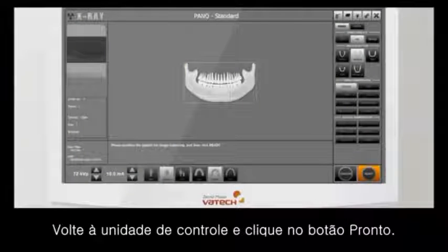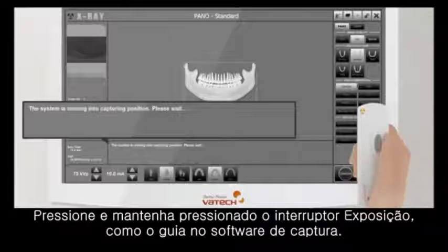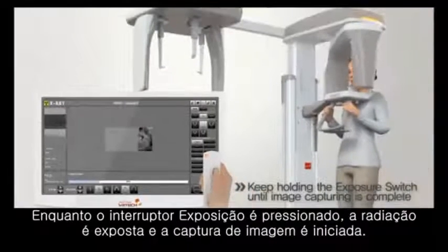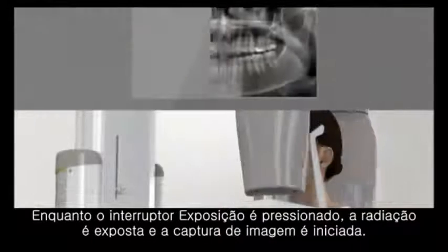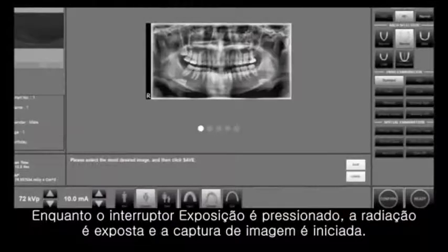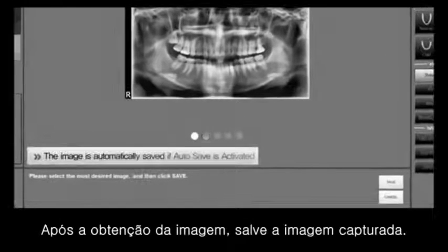Back to the control unit and click the Ready button. Press and hold the exposure switch as the guide in capture software. While the exposure switch is held, radiation is exposed and proceeds taking the images. After the image acquisition, save the captured image.